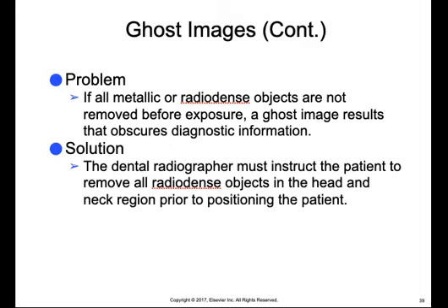The number 1 represents the earring on the patient's lower right ear, and number 2 indicates what the ghost image looks like for that specific earring on that right side. So it appears a little bit higher on the image than the actual object does. It will appear magnified and a little more blurry, almost like a ghost of what the actual earring looks like.